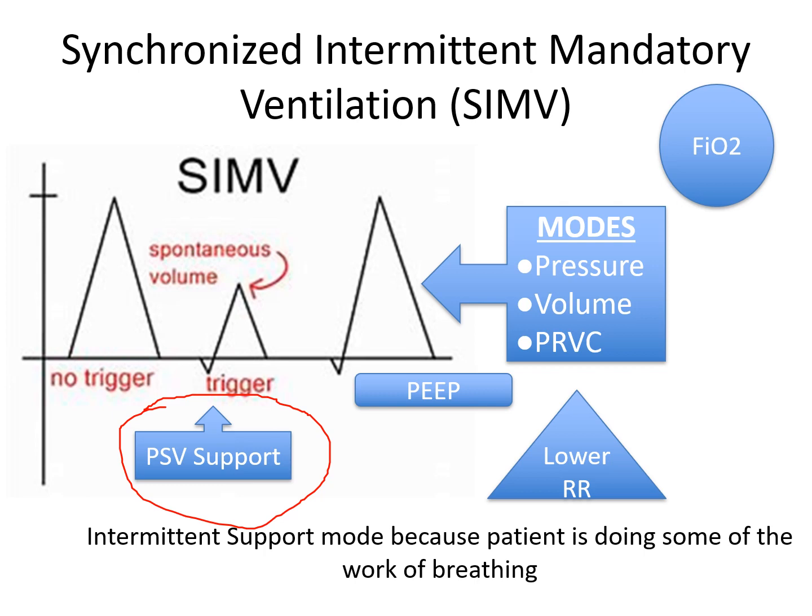And there's usually always PEEP. And like I said, you'll usually have lower respiratory rate settings. So again, that'll be depending on what the patient can do. But the lower respiratory rate settings will allow the patient to breathe on their own, and then that will help exercise them and maintain an adequate diaphragm so that they can breathe when they are able to come off the ventilator.